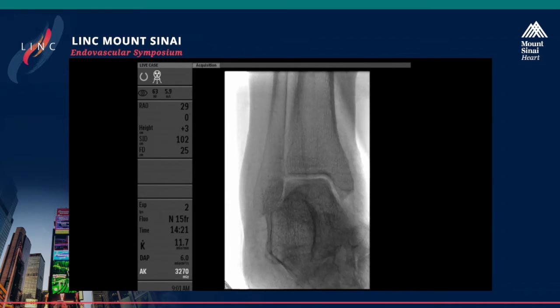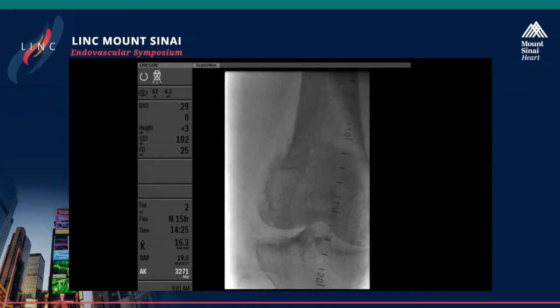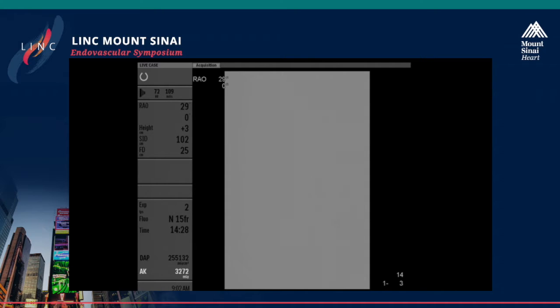Right. So I think the reason we presented it, I think we achieved our goal. There's tremendous controversy in terms of what to do in these patients. I know Dirk and I discussed this, it is really how do you deal with the common femoral when you have no bifurcation involvement?